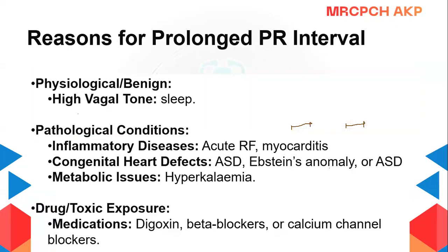Let's move to the next slide. I just mentioned in what conditions we are going to get a prolonged PR interval, but you should also know, and later we'll discuss the heart blocks, AV blocks as well, which PR interval is not bothersome, where you just have to observe it and don't have to treat it.